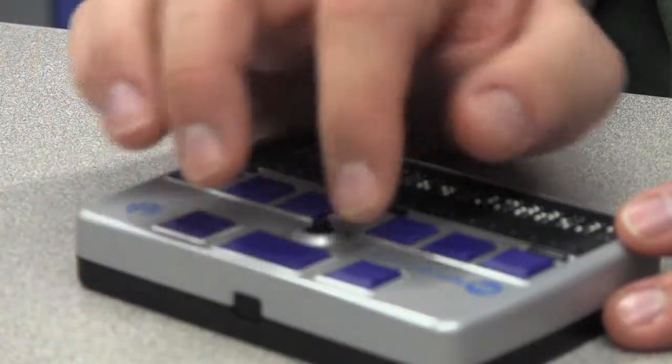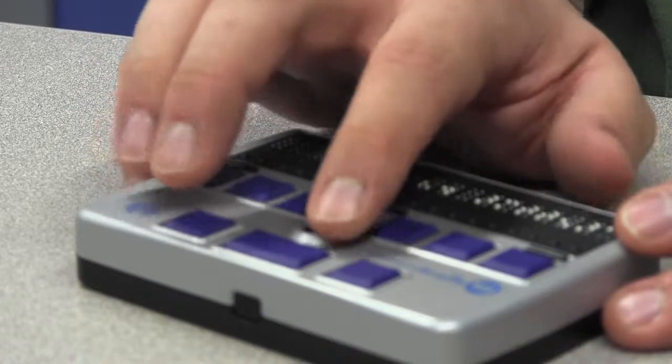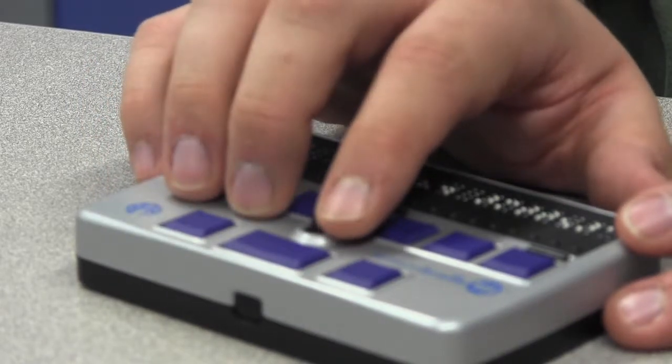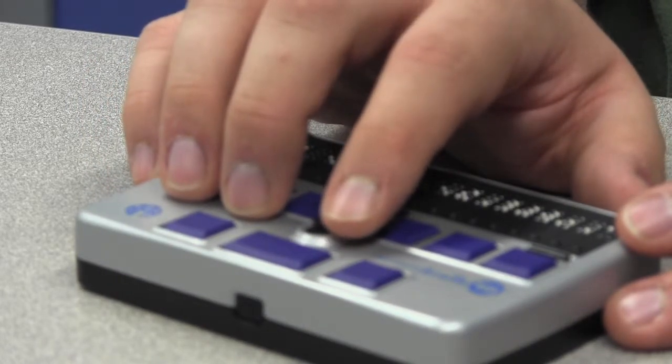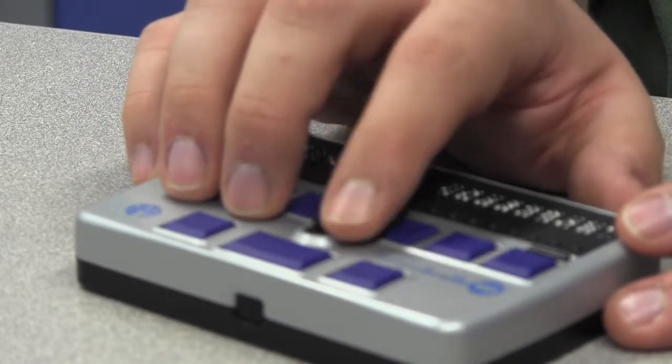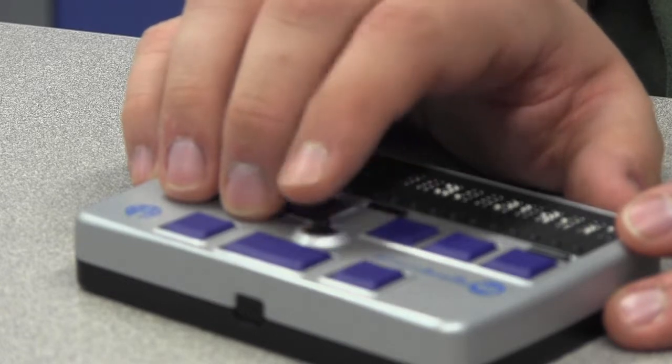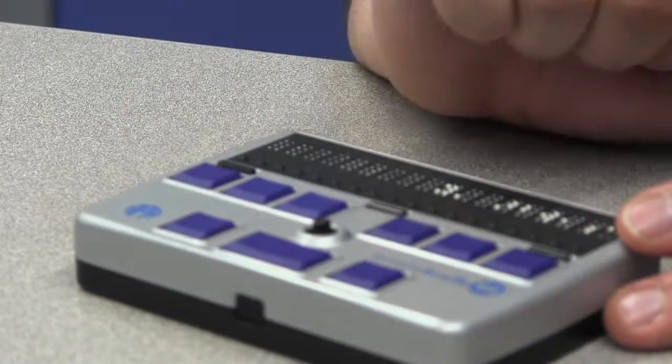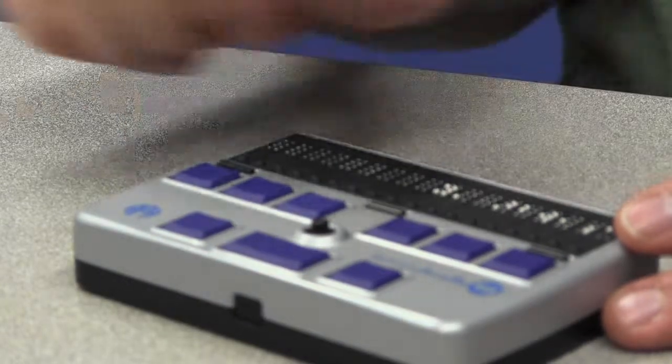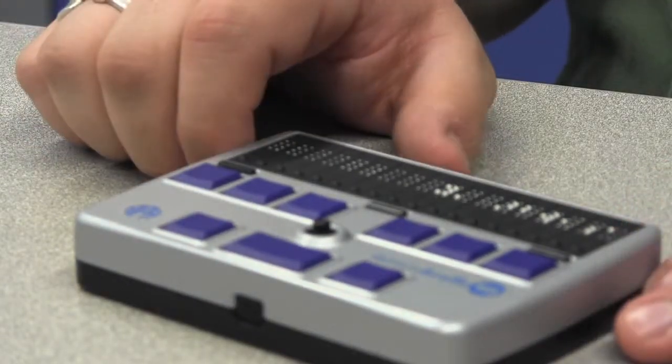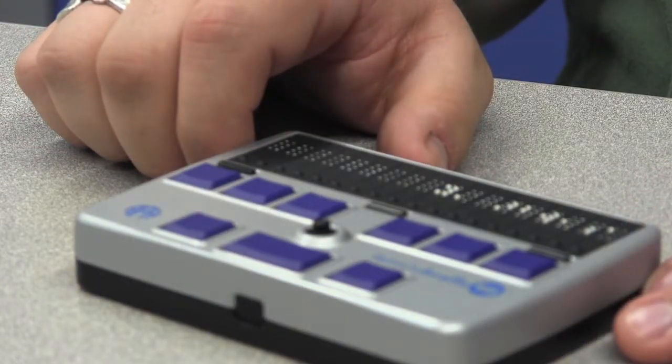And then I can use the joystick again to navigate through this screen. Airplane mode, Wi-Fi, notification, location service, brightness and wallpaper button. And there you have movement with the Braille display.